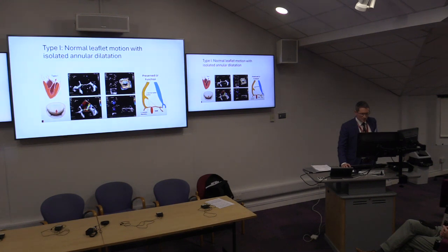So in terms of the patterns, you can see here in this left atrium a clearly dilated left annulus, and we've discussed this already. So this is a fairly central jet, usually easy enough to see, and it relates to issues around annular dilatation, but then that also has an implication on restriction of the valves too.